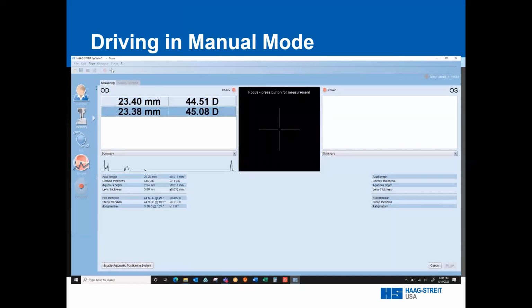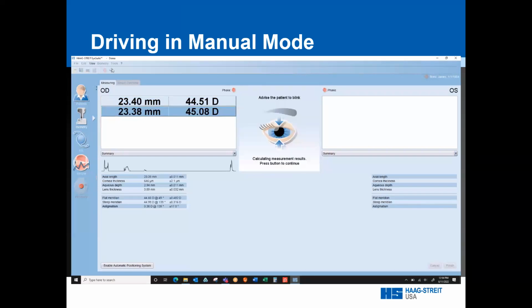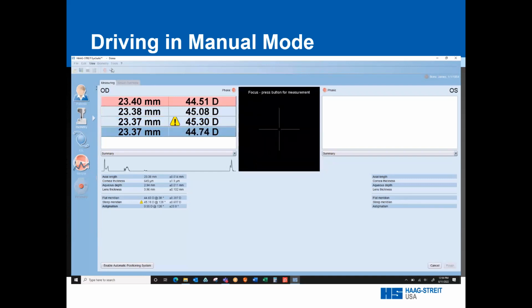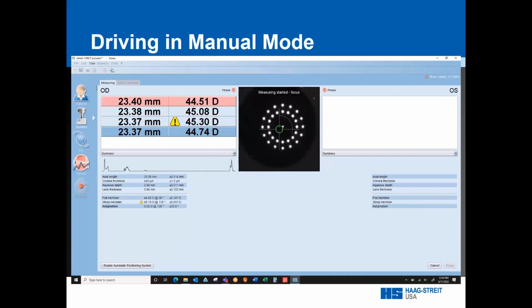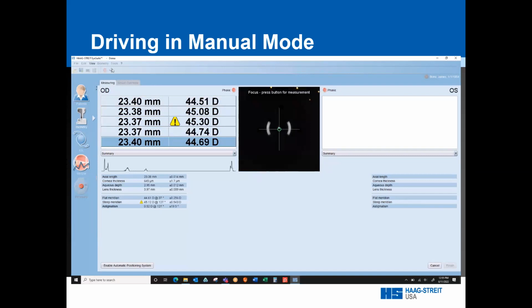So once I do that, I'm going to hold the Lenstar steady in that position, just using the joystick controls for movements up, down, right, or left to track the visual axis. If my patient stays fairly steady, I avoid forward and backward movements with the Lenstar, maintaining the distance throughout the scanning. So it's one click to turn the camera on and another click to scan in between.